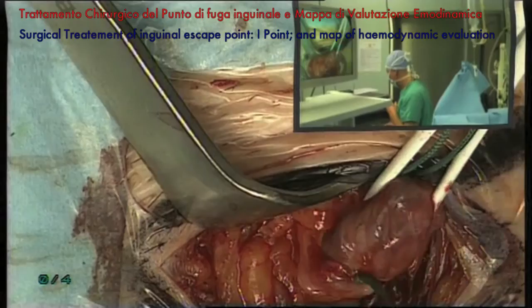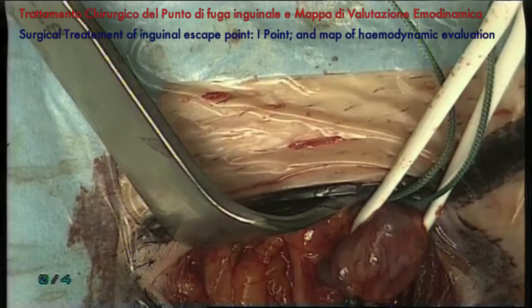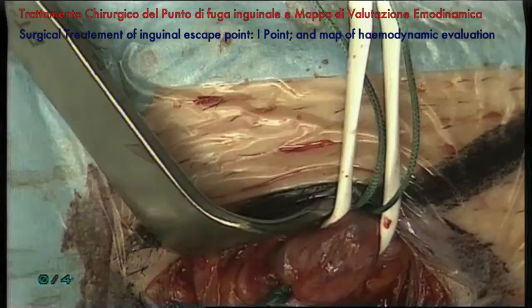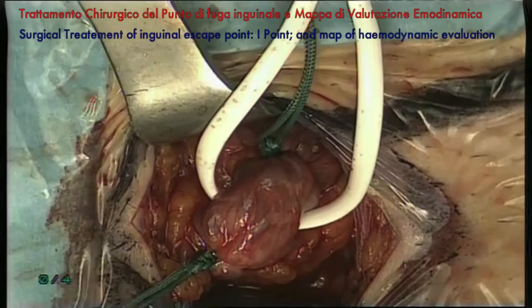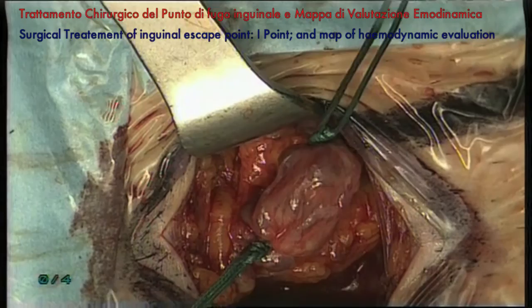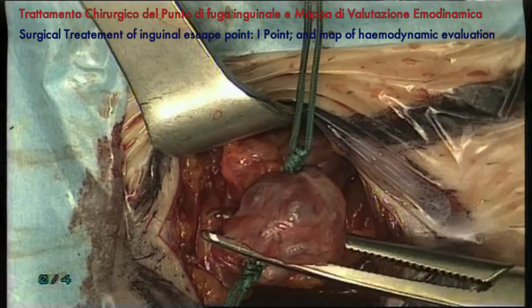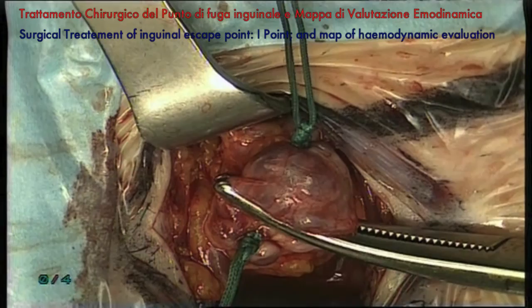We've just had a confirmation that we haven't touched any nervous fiber. Take this one off, Paolo. You can see that the plexus is very clean.